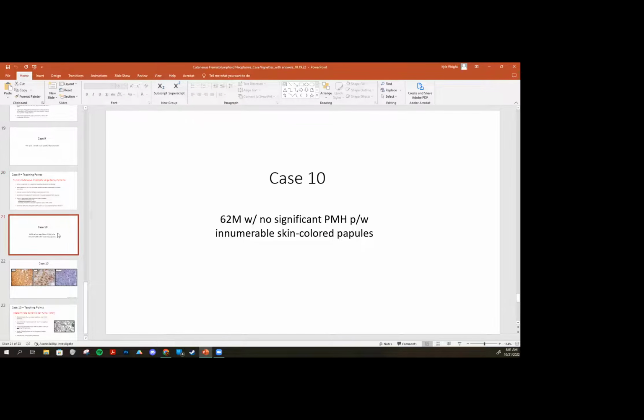All right, very quickly, case 10. I wanted to show you this case because, and I'll be happy to stick around too for some additional questions, Dr. Hassel. So for case 10, the reason I wanted to show you this case is it's a very rare bird. You probably will never see one of these cases in your career, but I wanted to show you because I had this in my records. If you're interested, this case is actually part of the ASH image bank and ASH reference cases on the American Society of Hematology's website. So you're welcome to see that case there where we've published this.